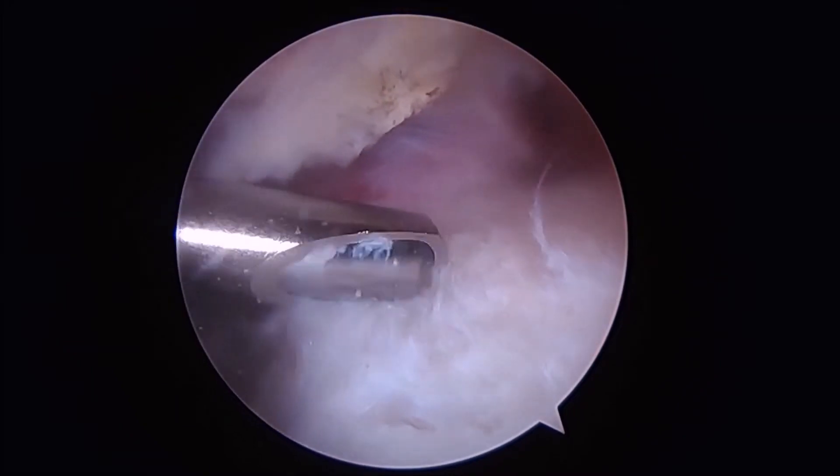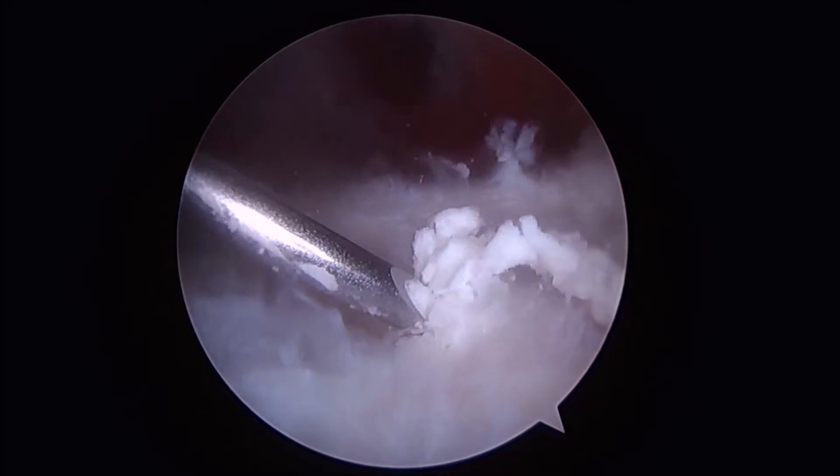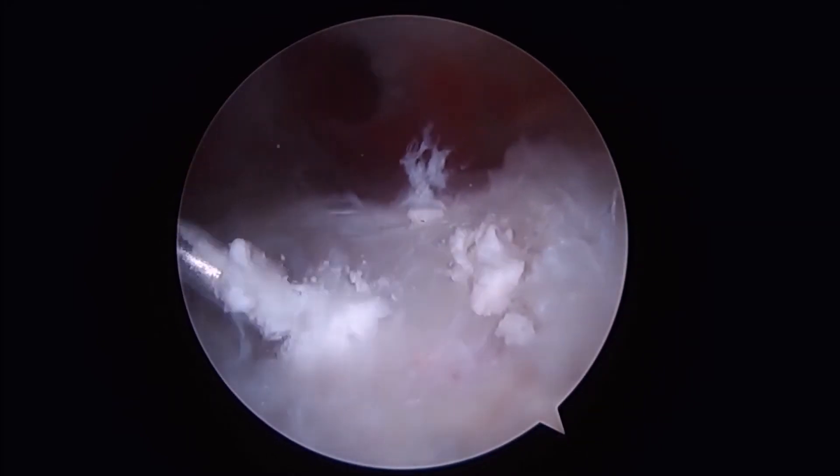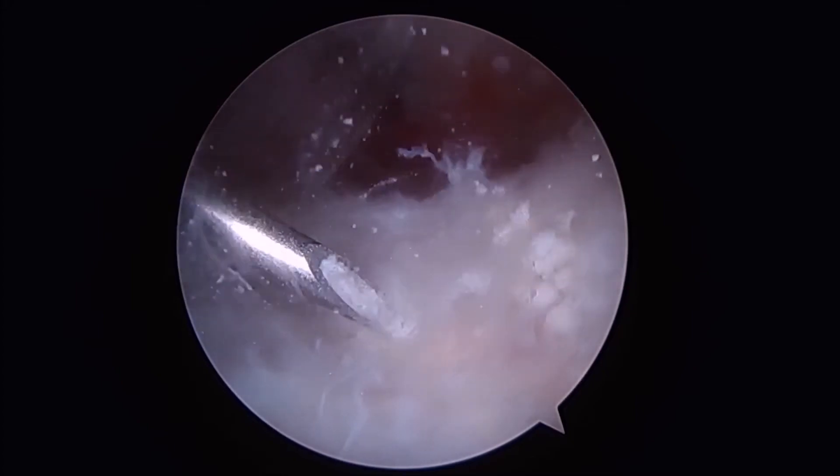A mechanical shaver is then introduced to remove the calcium depositions as well as to further allow for isolation of the calcium deposits. The spinal needle is reintroduced to help break up the remaining calcium.